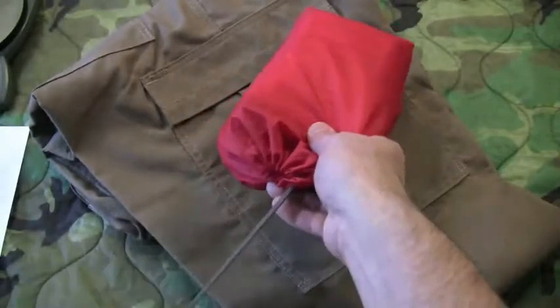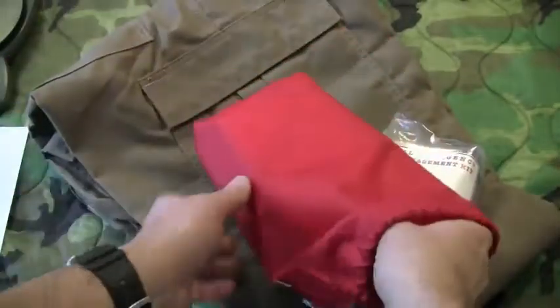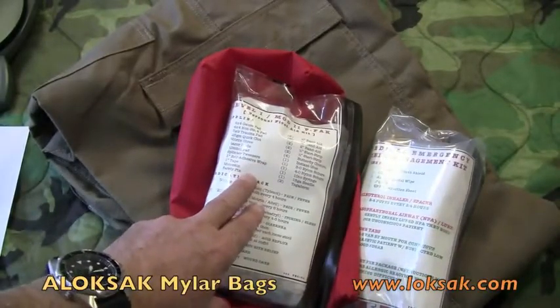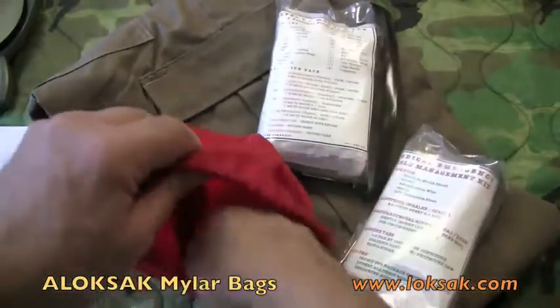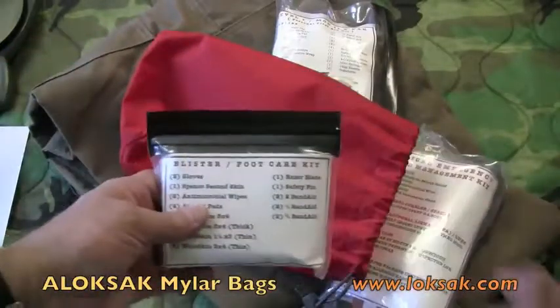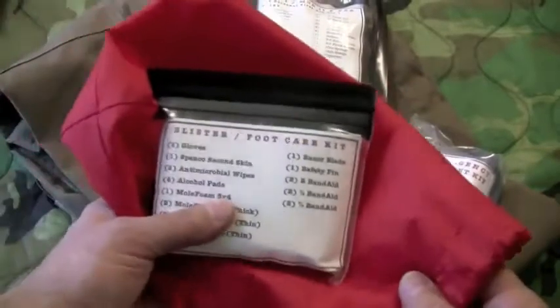Let's do a review on my medical emergency field kit. I got a number of private messages about what's in the red bag. As you may recall, that's where I pulled out my level one first aid kit. The other contents in this red bag are my medical emergency field management kit, which I'm going to review today. I also have extra gloves and a blister foot care kit, which I can review in a future video.